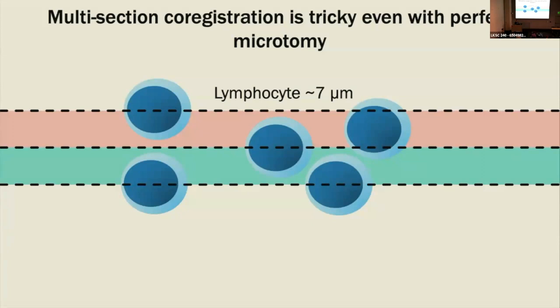So the exact fixation times are going to be variable depending on surgical schedules and exactly when the things were taken out. There's a lot of variation in that. You can try to limit that if you are able to get the specimens fresh out of the OR.